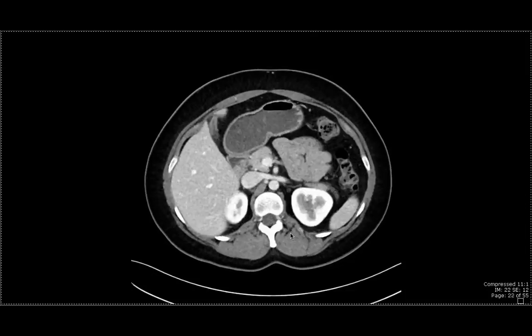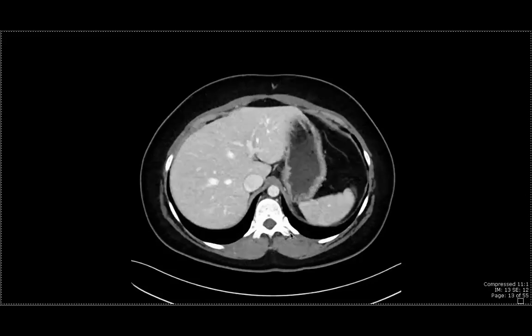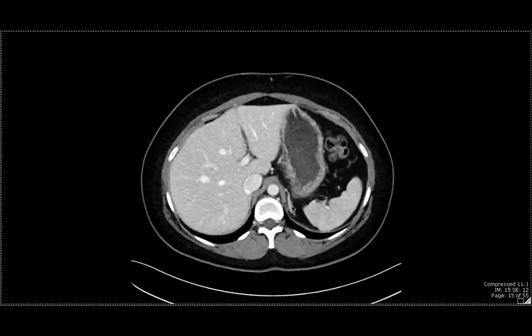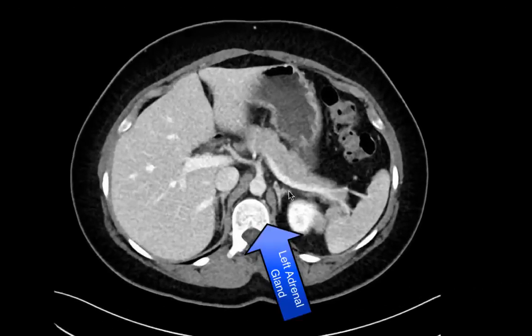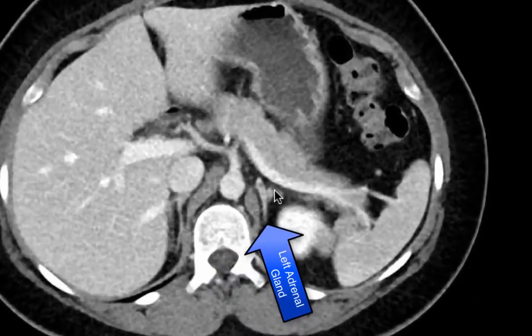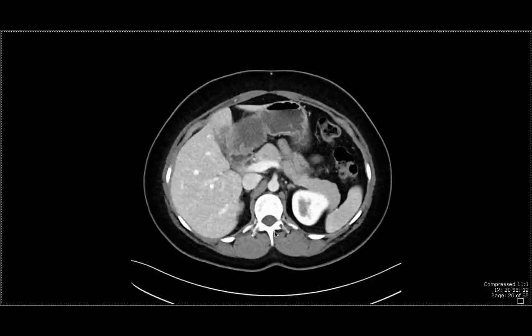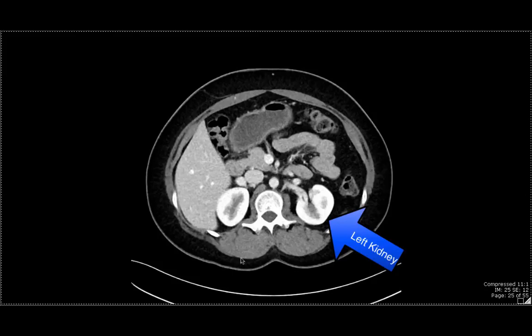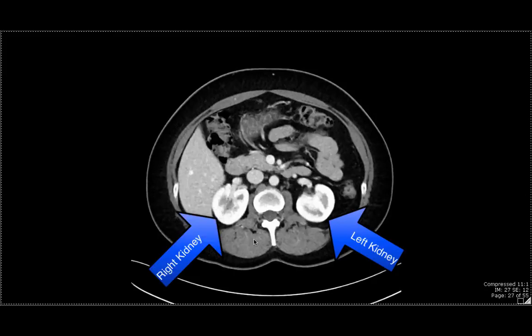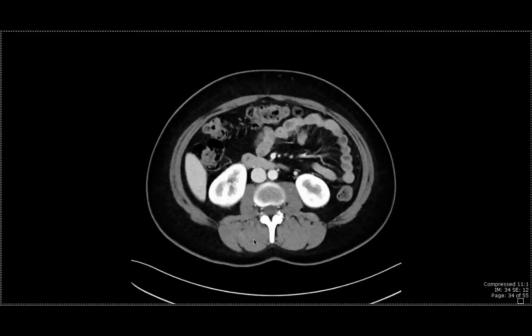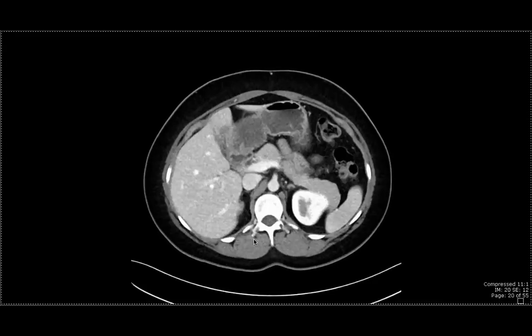Now I'm going to scroll upwards again. The next organ I'd like to showcase is the left adrenal gland. We can see it nicely over here, and it has this kind of triangular shape — we'll appreciate that triangular shape more clearly on the coronal slices. On this image, we can also see a portion of the right adrenal gland. As we scroll downwards, we can see the left kidney and the right kidney, scrolling all the way down to get the full extent and back up again to see what the kidneys look like in the axial plane.